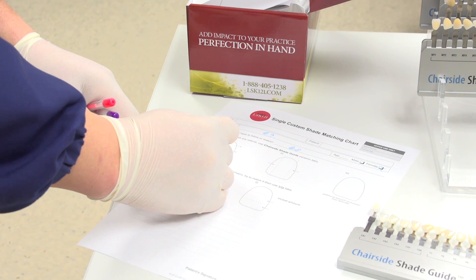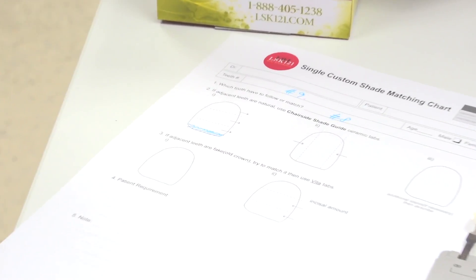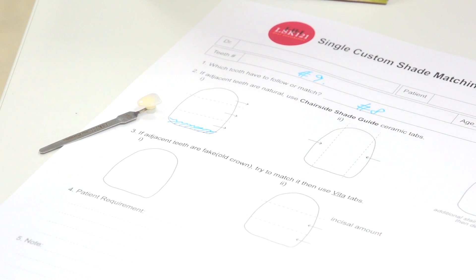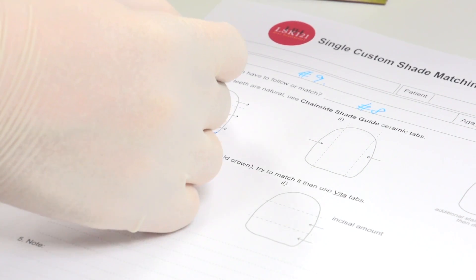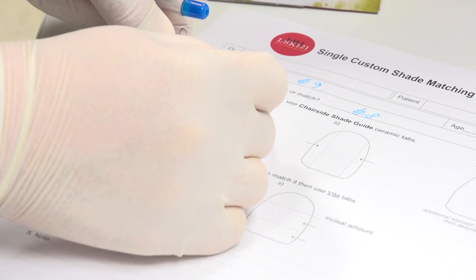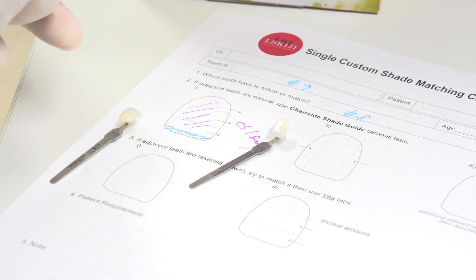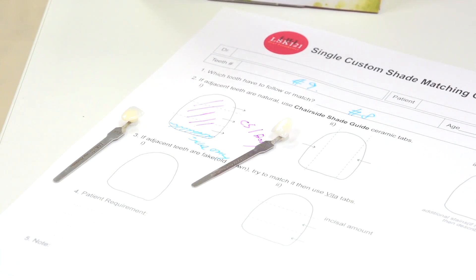The color is pretty simple but bleaching white. I noticed the incisal area has a heavy transparent color, which I indicated as Y12. All the rest of the color is CS1 — a really bleaching white — so the technician can follow CS1 for the body and Y12 transparency for the incisal only.